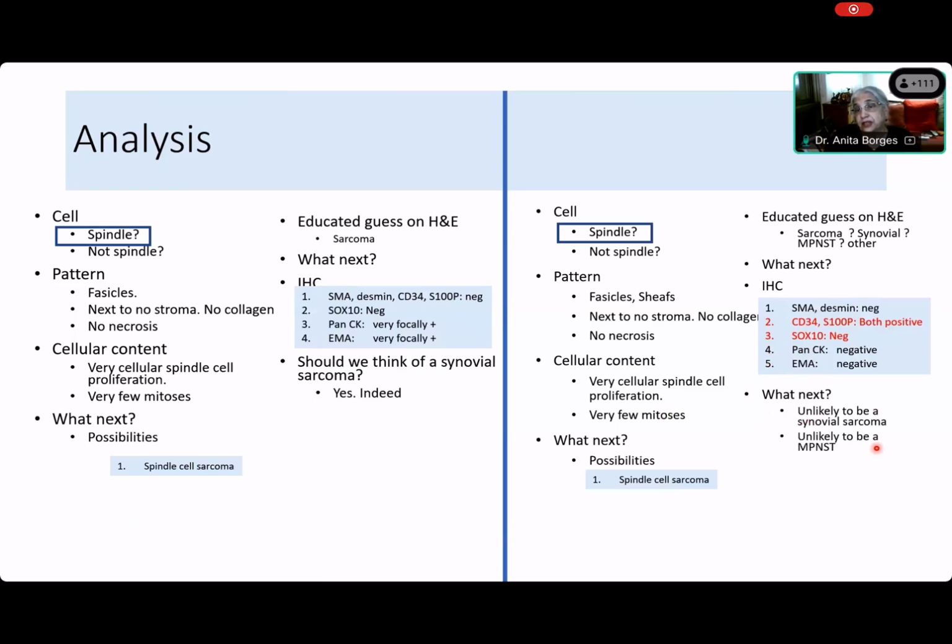It's unlikely to be an MPNST. Why is it unlikely MPNST? It is a malignant peripheral nerve sheath tumor. SOX10 is negative, but it might be negative. And there's no necrosis, ma'am. There is no necrosis. Wonderful. Absolutely. There is no necrosis. Nobody should make a diagnosis of an MPNST without necrosis. I mean, you have to be with your back to the wall and you can't think of anything else if you want to call an MPNST an MPNST when there is no necrosis. So there is no necrosis, so it is extremely unlikely to be an MPNST. No, it's quite possible that it is some uncommon entity and we will have to find out what.